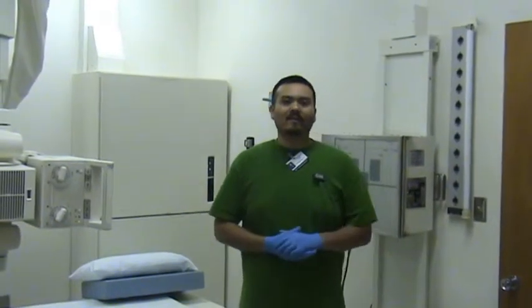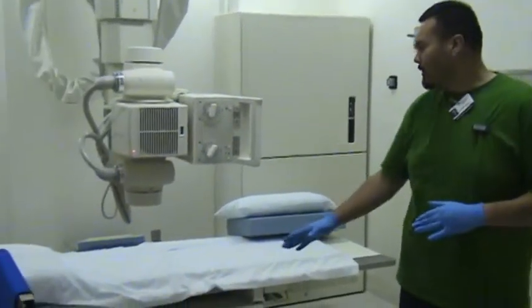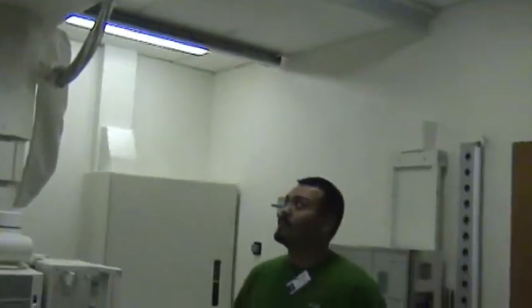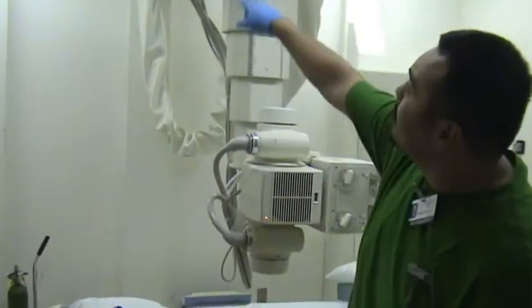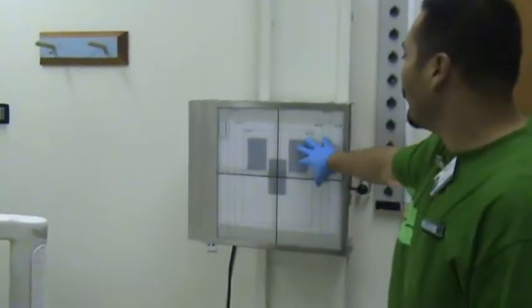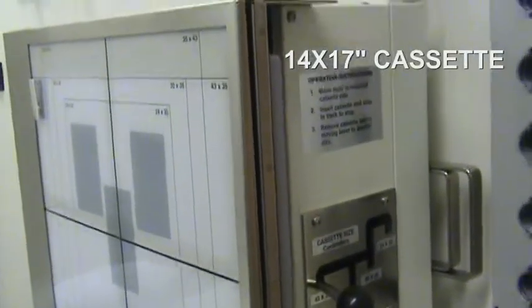Before you even get started, make sure that your room is nice and clean, organized and free of anything that might be an obstruction to the patient. Make sure it doesn't look like there was a procedure just done here. You want to detent your machine to 72 inches for a chest x-ray, and make sure you have it nice and set, and your marker ready to go. Here we already have it lined up and we are just waiting and going to get the patient. So let's go ahead and do that.